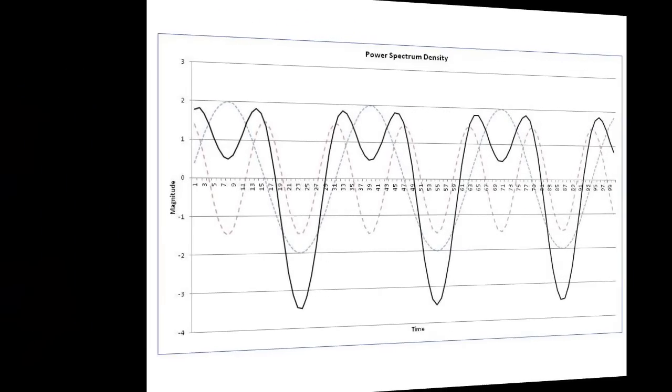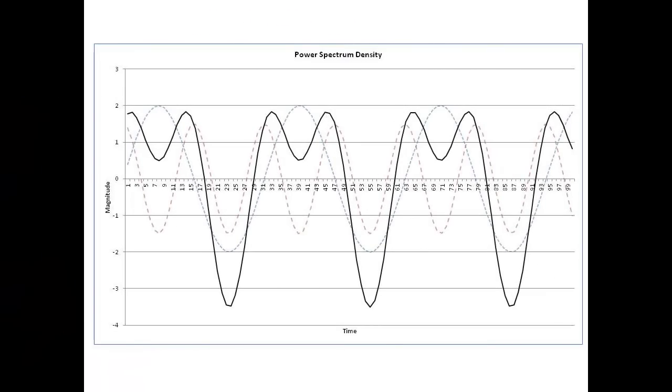Before looking at the data that the heart rate variability software is generating for us, it'd be good to understand exactly where frequency domain analysis is coming from and what it's doing. Most times, a wave that you see is not everything that you're getting, so to speak. Most waves in nature are composites of many other waves. For example, an oversimplified version is the black wave that you see on the screen in front of you. It oscillates with this odd bimodal pattern, and it's very difficult to tell what the frequency might be.